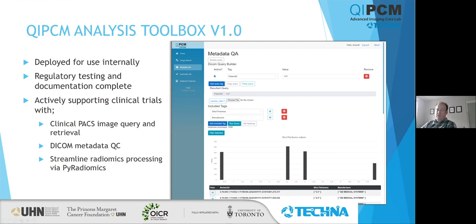One of the major use cases we have is for clinical PACS image query and retrieval. This is where we would query clinical PACS and pull down a bulk retrieval for a trial. What's great about ours is that we can filter right down to the series level — for example, if they only need axial images, we don't need to pull all the different MIPs and coronals and sagittals. When you're pulling down 20,000 patients' images, it makes a big difference if we're only pulling one series for each as opposed to five, for both speed and total storage.